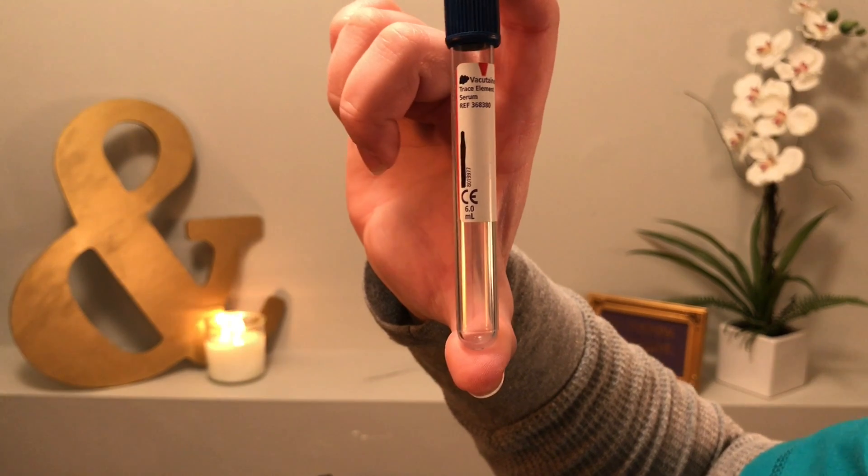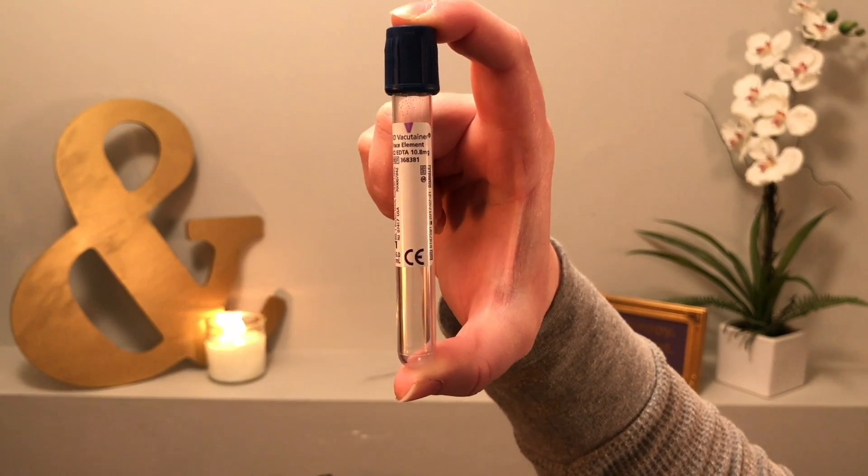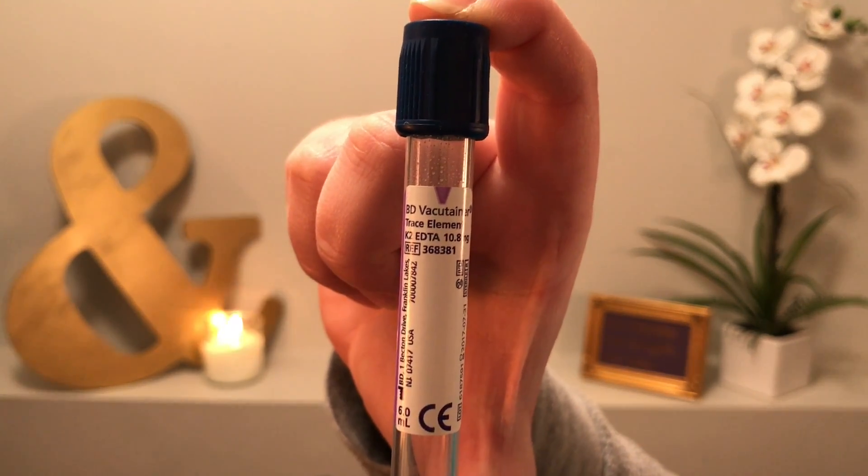These next ones I'm going to show you — there are two different ones and they're both a royal blue color. I got confused and couldn't really figure out which one goes where in the order of draw. The one I found was the royal blue with no additive — this is supposed to be the second in the draw. What this is really looking for is metals: copper, lead, anything like that. Sometimes we use it for medications we might be looking for in patients' blood. The other royal blue tube also does metals and toxicology. When you're a medical assistant, you'll know which tubes you're supposed to draw.